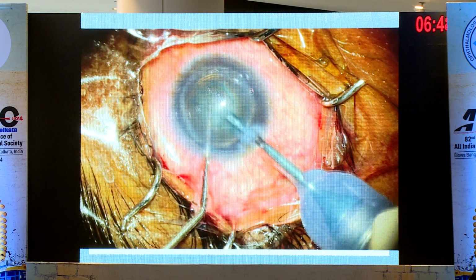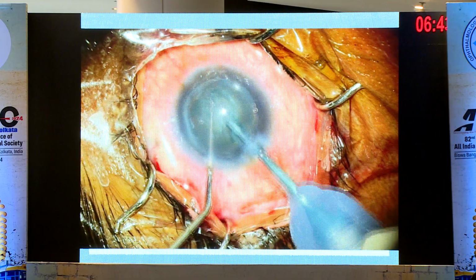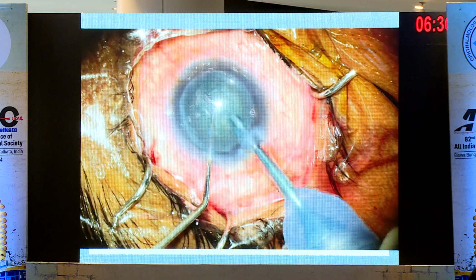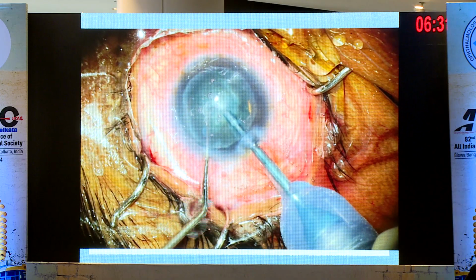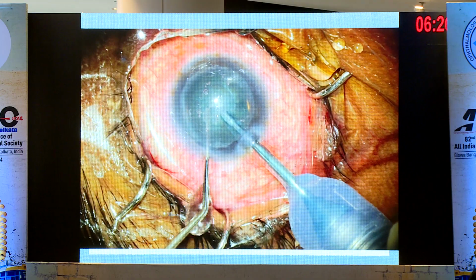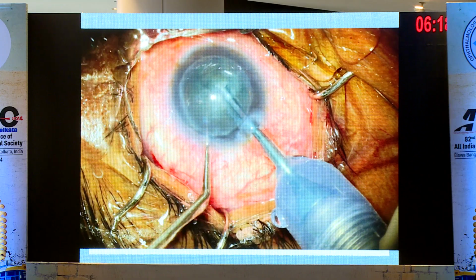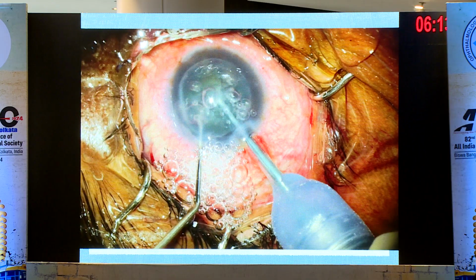Rest of the steps of phacoemulsification are routine, except that again you want to approach this case like a case with a precious endothelium, because it is precious endothelium. You have an endothelial graft there, and we know that even if the graft is clear over time, most of these corneas do lose a lot of cells, and sometimes you may have a clear graft with as low as 500 or 600 CD count. So just try to do an in the bag slow motion phacoemulsification, with repeated injections of OVD.